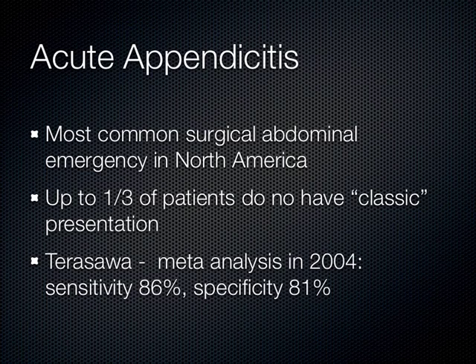And certainly when I have a kid in my ER, 10, 12, 14 years old, I really try to avoid getting a CAT scan on them, though sometimes I have to get it because the benefit outweighs the risk. Now, if we could get good with ultrasound, though, and see a true appendicitis on ultrasound, we could avoid the need for a CT scan, and especially in a younger patient. The average age of somebody who gets appendicitis is 27 years old.